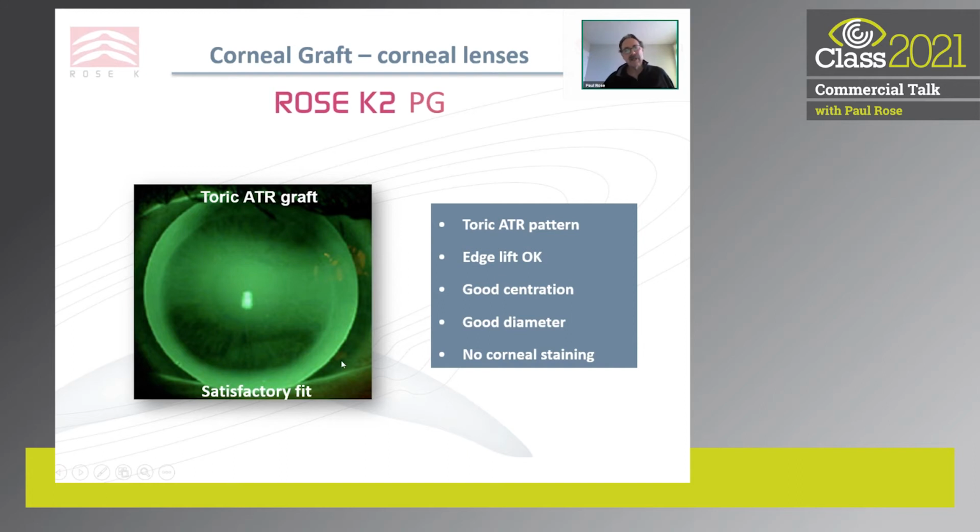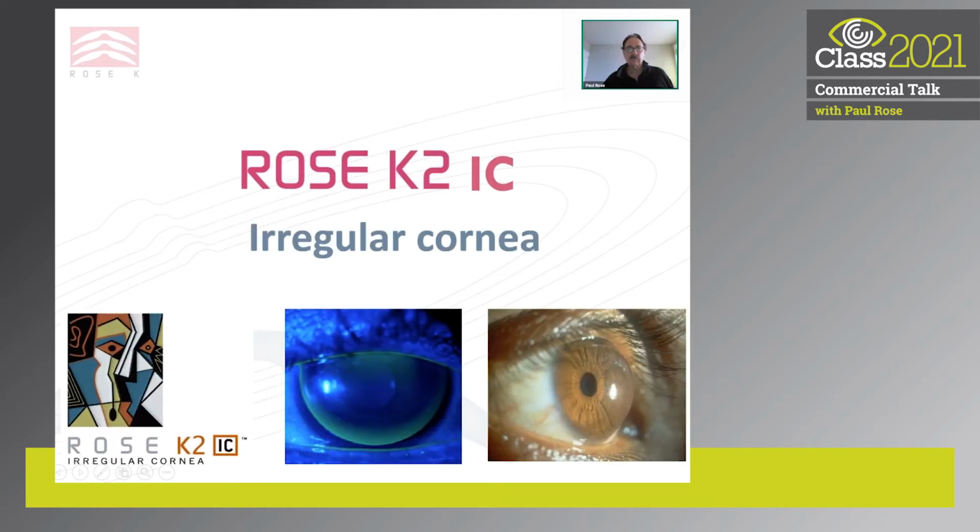How would you improve that? Pretty hard to improve without making it quite a complicated lens, where over the central optic zone you had toricity, and outside of that you simply had a sphere. I don't, unfortunately, offer that design in Rose K.